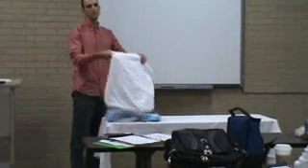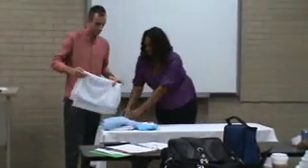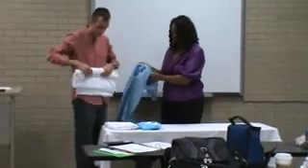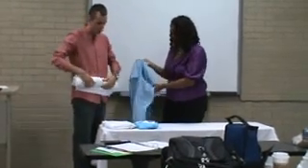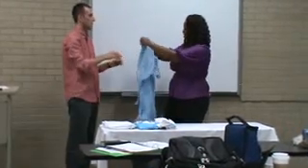Now we will demonstrate the injection of contrast with the needle. Has anyone seen this exam before? We're going to show you how to inject the contrast, and I'm going to have the patient get dressed.